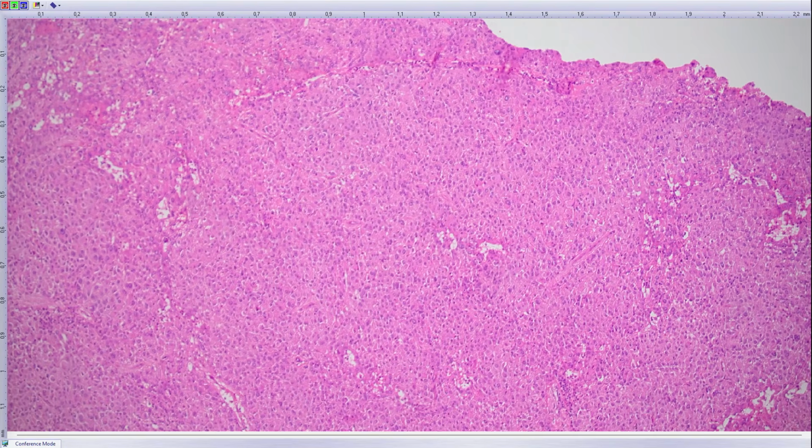And tumors with PDGFRA mutation, again, compose 10 to 15% of GISTs. They present exactly with this kind of epithelioid morphology, and are typically found in the stomach as well. So for me, that was the number 1 differential.